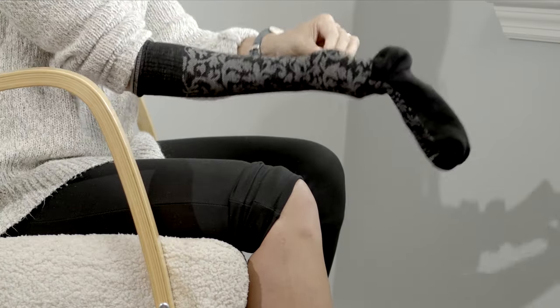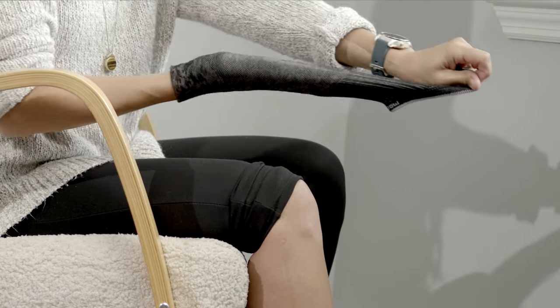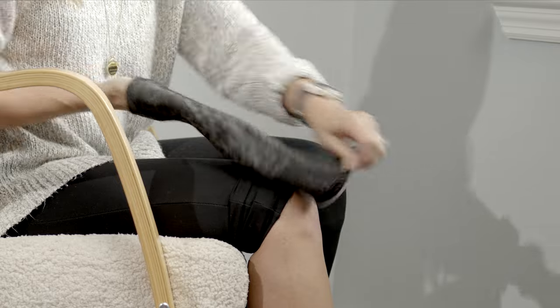Pull the sock over your hand until the heel of your hand meets the heel of the sock. Peel the leg of the sock down to the heel of your hand so that it's partially inside out.